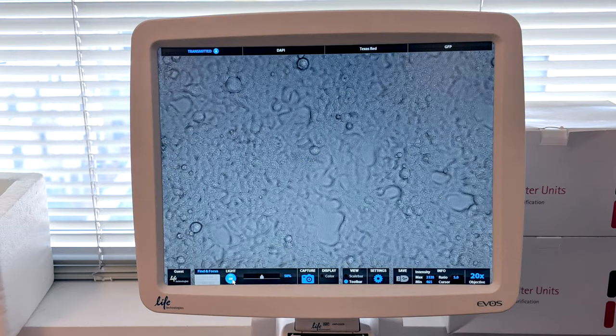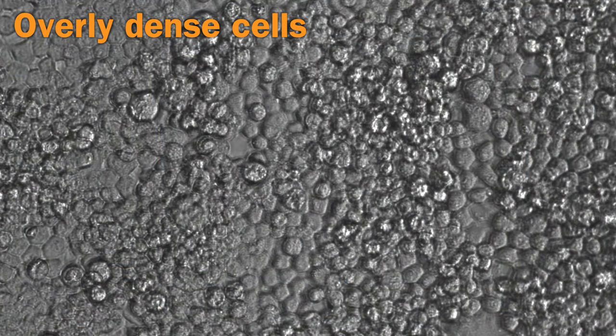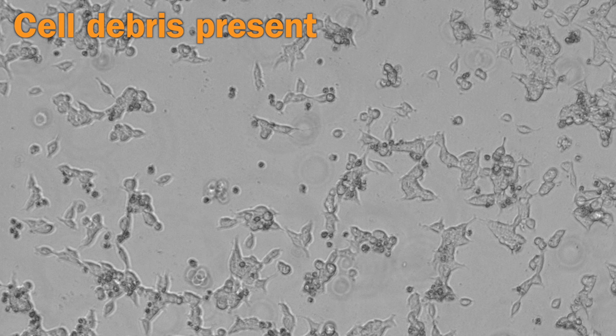Before working with your culture, check for signs of microscopic contamination with the high power objective of your inverted microscope. Often, low levels of contamination can be observed in the microscope before they can be observed macroscopically.